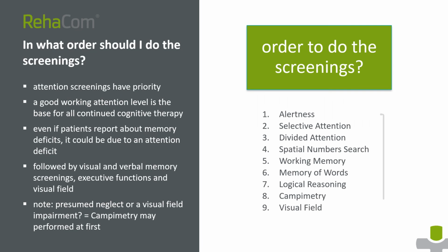Another frequently asked question is about the screening order. Due to the fact that a good working attention level is the base for all continued cognitive therapy, attention screenings have priority within the order you should proceed with the screenings. Particularly, please keep in mind, even if patients report memory deficits, it could be due to an attention deficit.